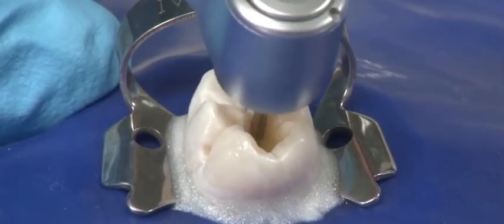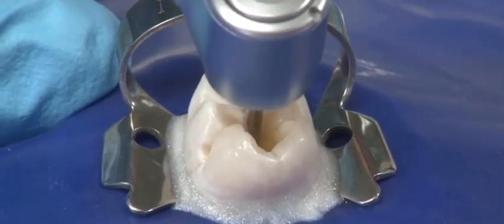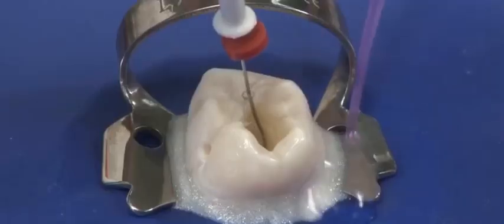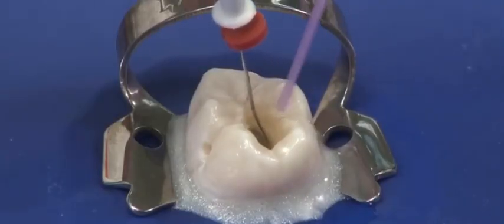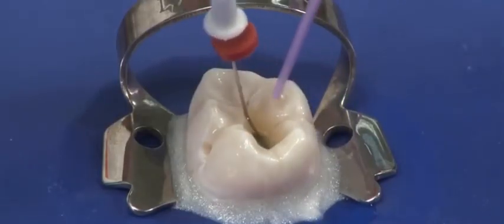Flare the canal to partially remove canal contents and establish patency to your temporary working length. To ensure proper apex locator measurements, verify that the canal is not completely dry.